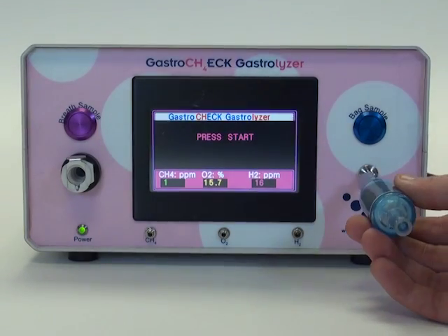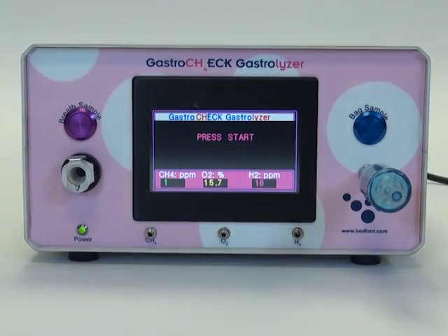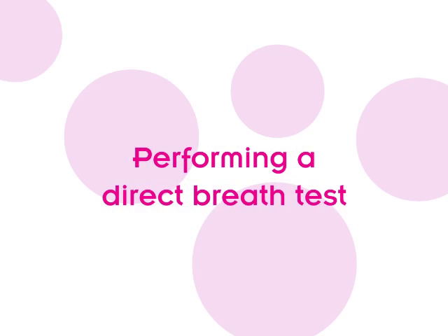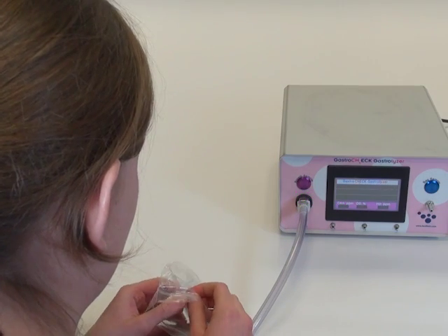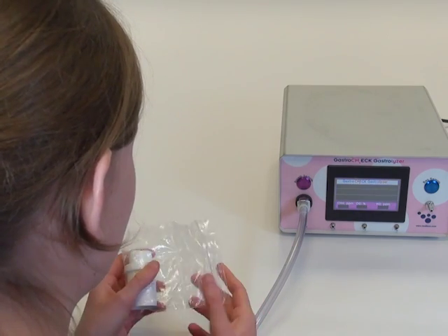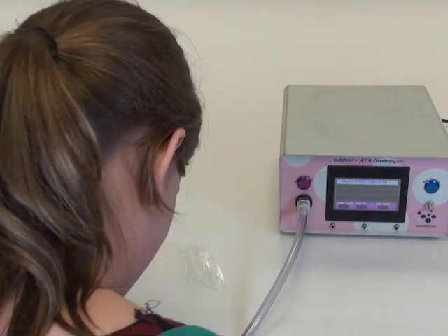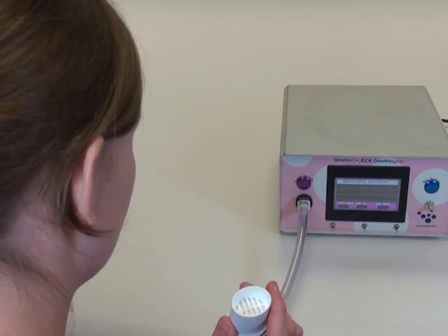You can place the moisture removal filter onto the monitor if you plan on making a bag sample test or taking a direct breath test. The patient should remove the mouthpiece from the packaging and push the smaller end onto the silicon adapter on the breath sample line. When the patient is ready, press the breath sample button to begin the test.